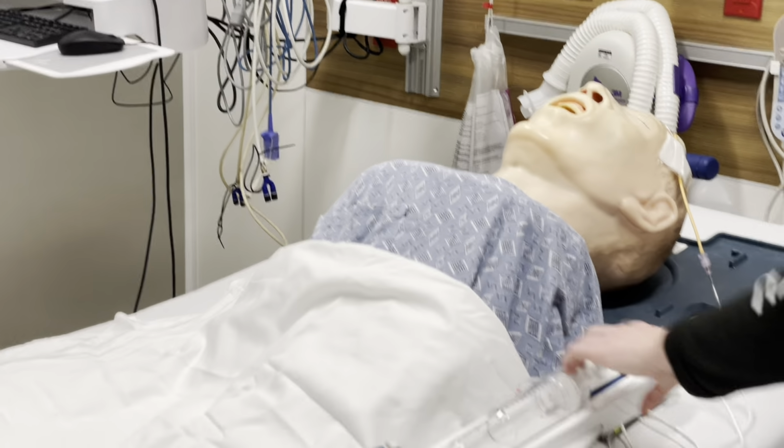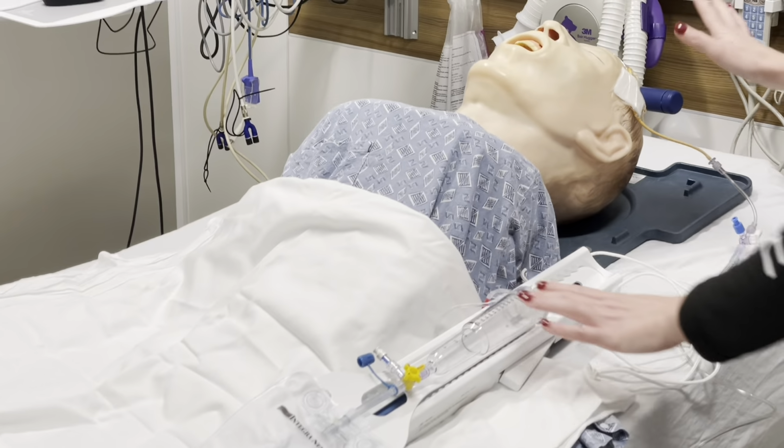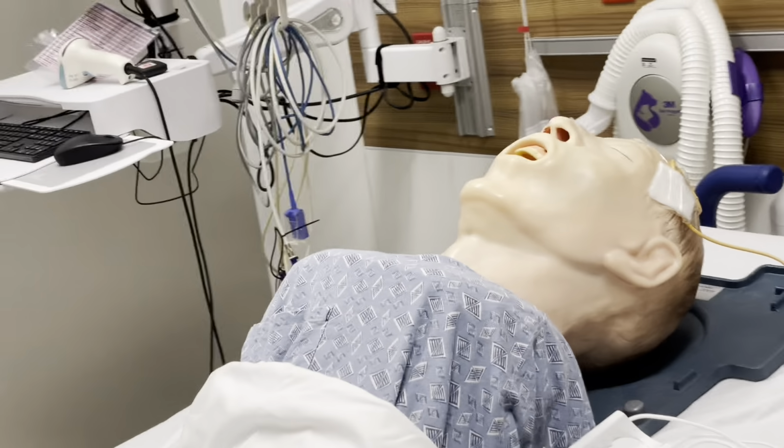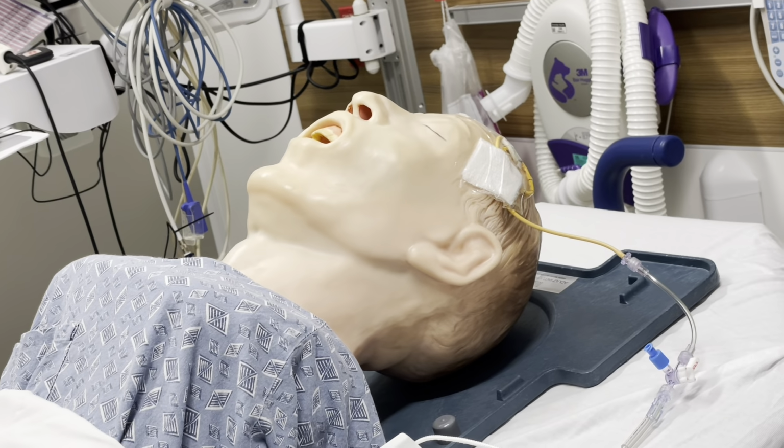You're also going to take a look at your site, make sure that nothing's coming up and that you don't have any crazy bleeding, swelling, anything around this area that you again would need to be contacting neurosurgery for.